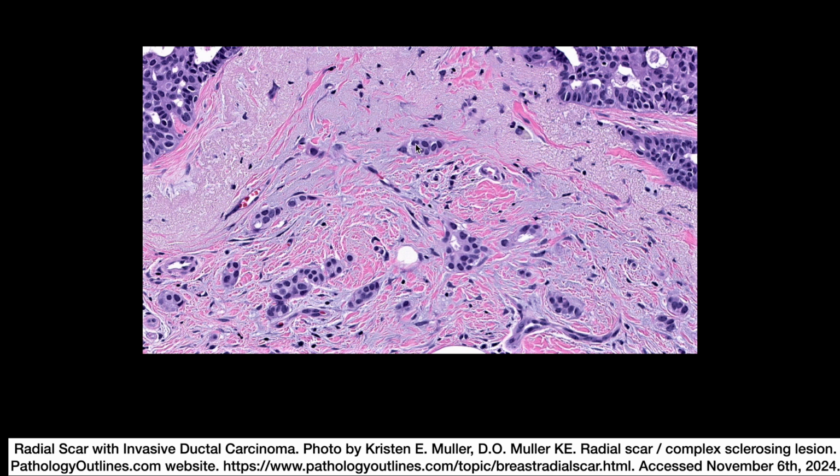But here we see single enlarged hyperchromatic nuclei cells that are not fibroblasts, which are more spindled, but single cells in the stroma, which is concerning for cancer. Here's another single cell in the stroma. And then we also have nests of epithelial cells that are angulated without any lumens in the stroma too. So this is definitely concerning for cancer.